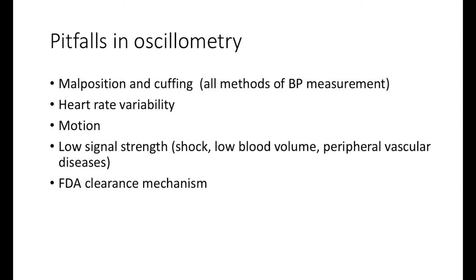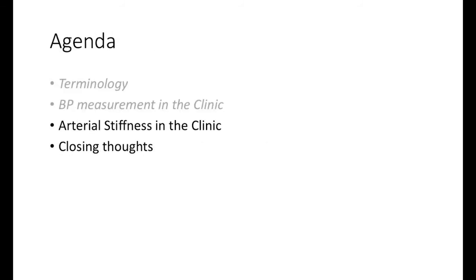So until you actually measure the thing against some standard you trust to say to a patient, yes, that monitor is working in you, you just don't know. So if you have a lot of faith, go for it. If you want to know better, cut the cards, look at the thing in the office setting where you can verify it. Final thing here is about arterial stiffness.